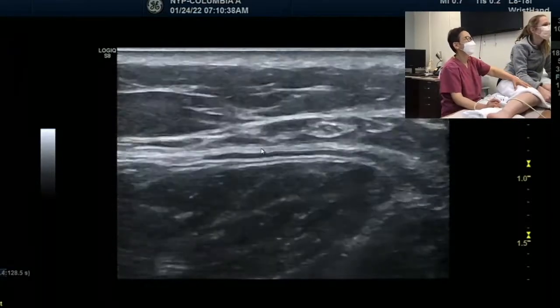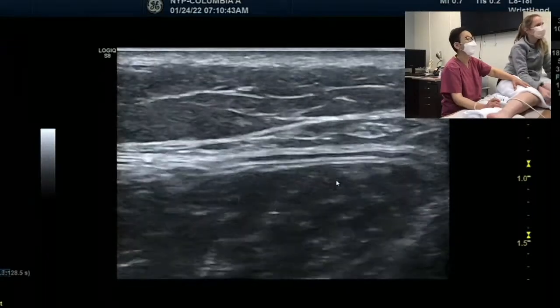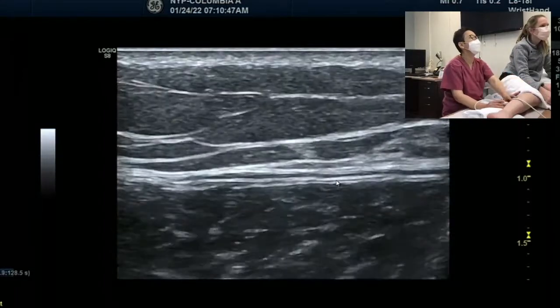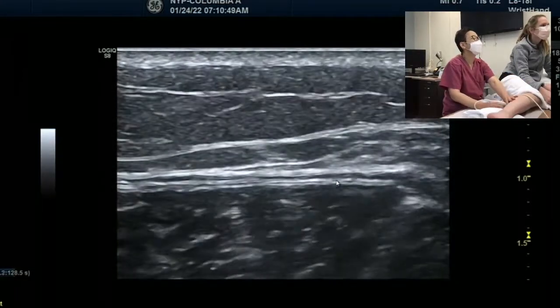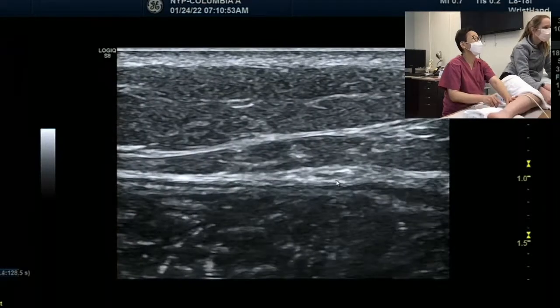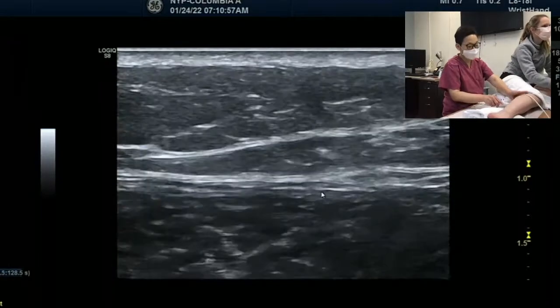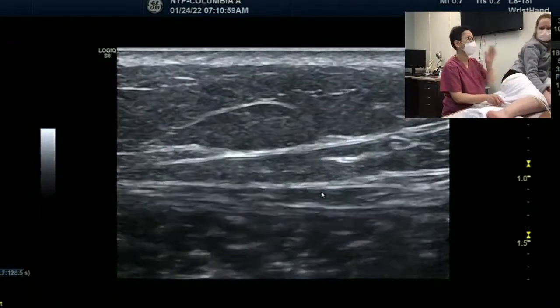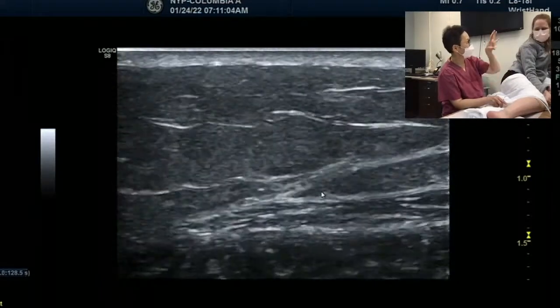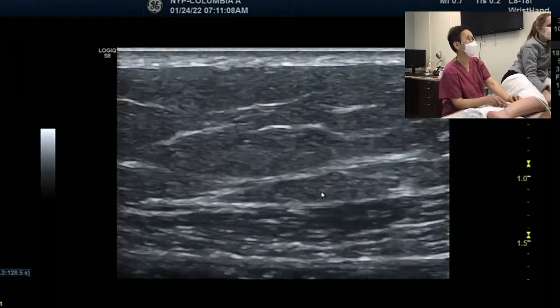Okay, look. See? Now it's clear, right? It's in the adipose tissue. And then if I go up more, did you see? Now it's on top of the gastrocnemius. If you reviewed the previous one, where the medial and lateral gastrocnemius meet, that's the place the sural nerve sits.